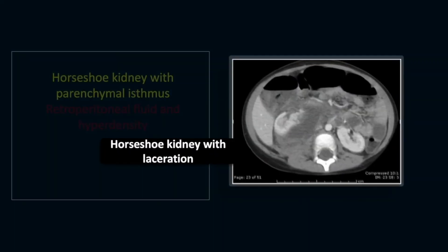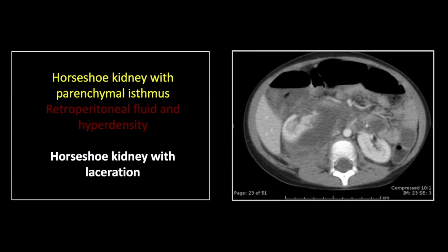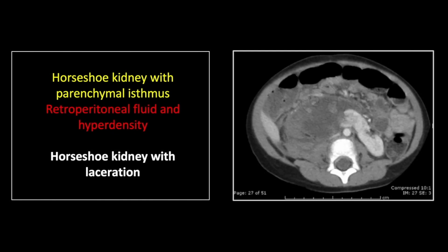Our next case is a horseshoe kidney with laceration of its parenchymal isthmus — the dreaded trauma complication of a horseshoe kidney. You can see the irregular sheared aspect of the inferior right kidney with a large amount of perinephric fluid. On a lower cut, the horseshoe kidney is much more apparent. That left kidney got a greater share of the parenchymal isthmus that you see sheared here. Note the blush of density along that irregular surface — a common finding in sheared parenchymal organs, representing small fragments of parenchyma that maintain their vascular connections, not active extravasation. There is also density consistent with clot formation in this large perinephric fluid collection.